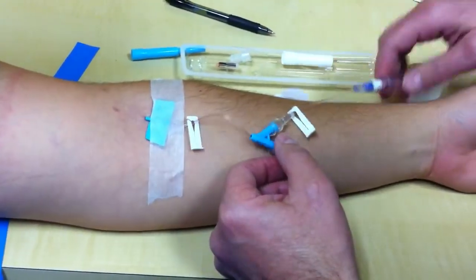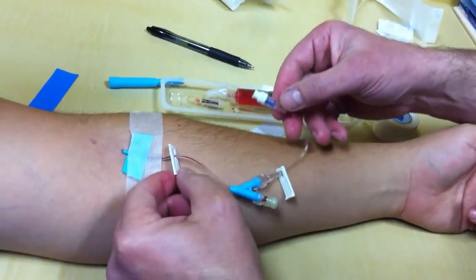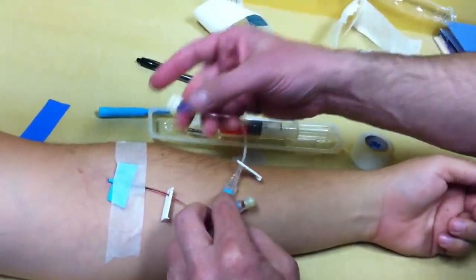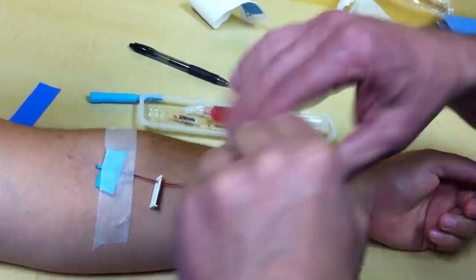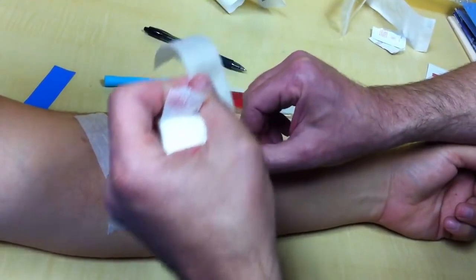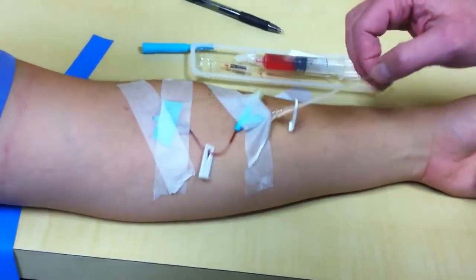Don't forget to tape everything down. This is a one-way valve, so once you disconnect this, nothing will flow out. You can turn this off — this will keep blood from flowing out. But if you have a one-way valve, you don't need to use this. Tape this down, make sure you tape it really good here. One piece maybe at an angle this way, so that your IV extension line doesn't pull the catheter out. Notice we leave a little loop here and then tape this down — that way if this pulls, it doesn't pull your catheter out.